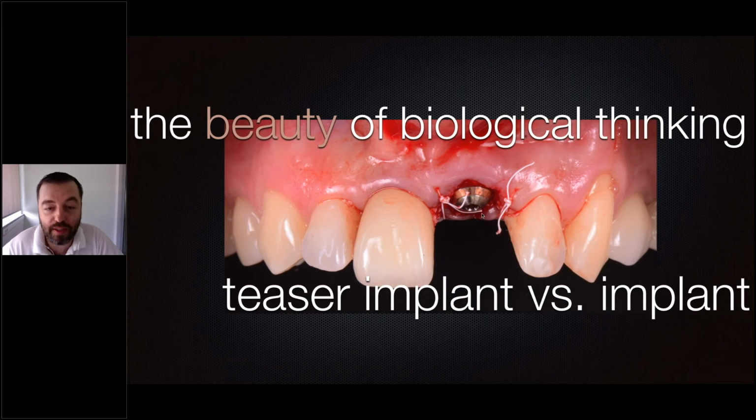And for the other one, we were able to extract and place the implant immediately. Again, it's flapless, but the bone was preserved. So he fractured it, and then he immediately came to our office, so he did not lose the buccal bone. This was the difference.